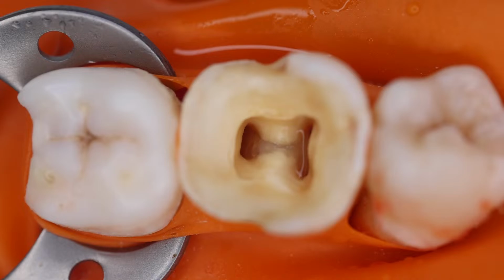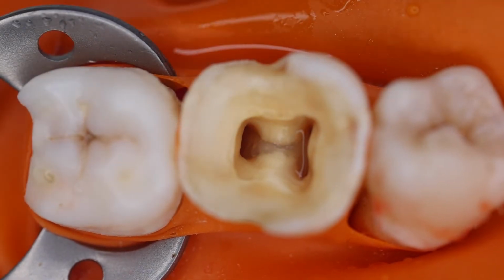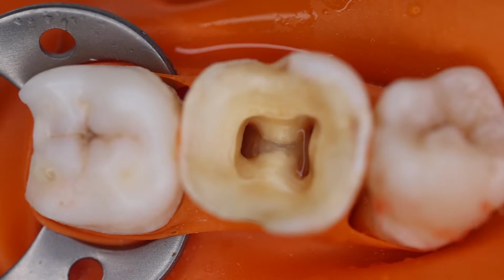Over here it is reading around 19 mm for the distal canal orifice. We would withdraw the file and clean it. See, the file came out curved, so the angulation of the canal is a little curved.